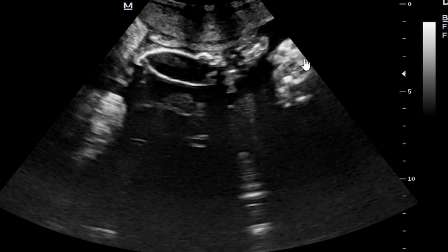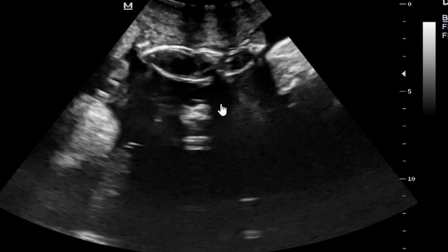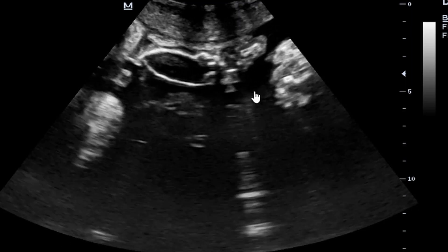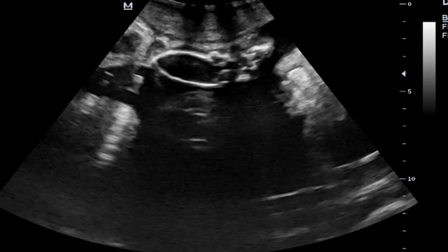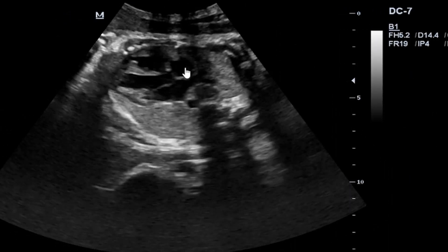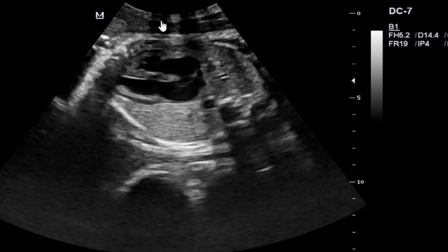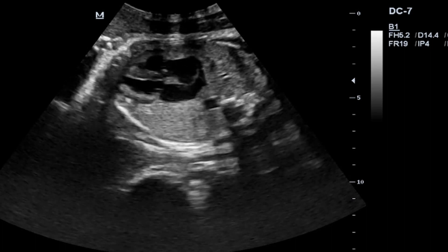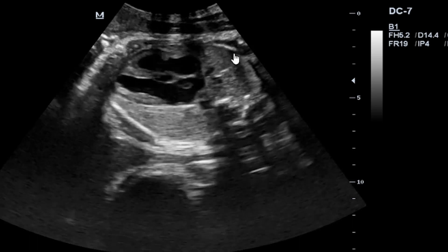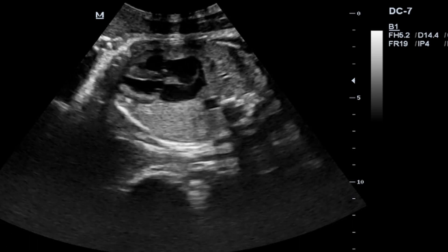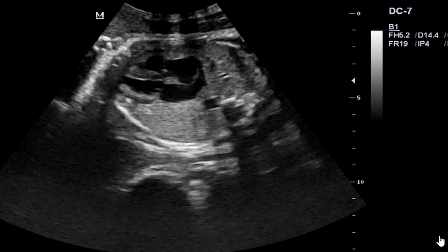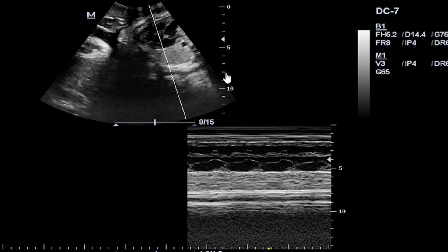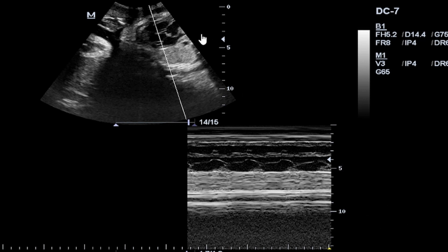Fetus B is actually macerated and undergoing the process of resorption. It is not affecting fetus A. Fetus A is actually doing very well and the pregnancy is progressing normally. Looking at this, you can see that twin A is doing so well — this is our nice fetal heart, all the chambers are very nice, and there is actually a normal heartbeat.